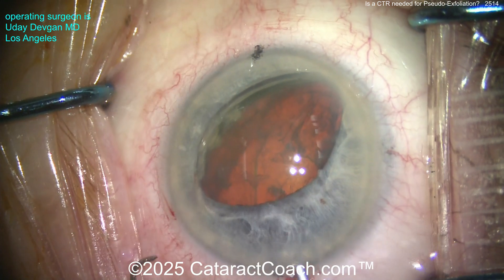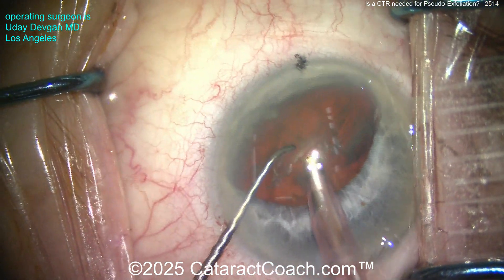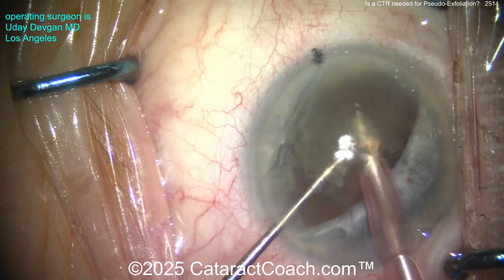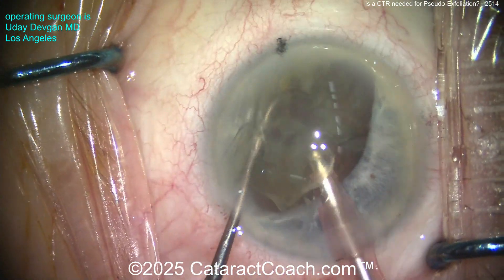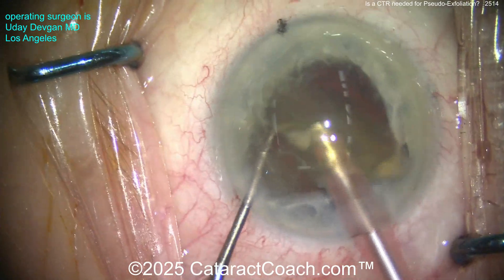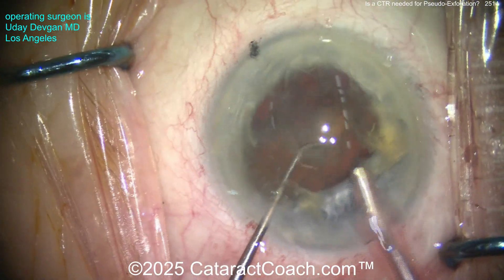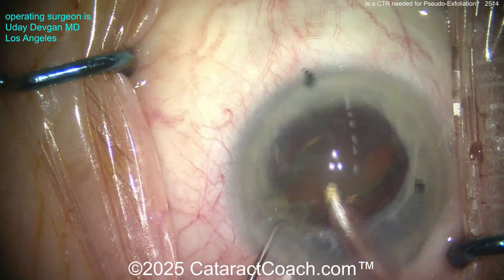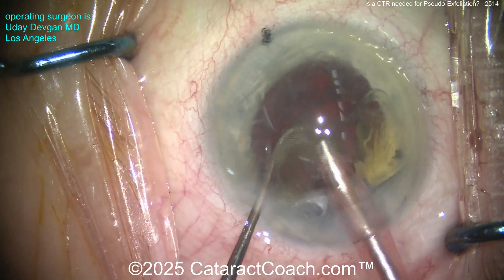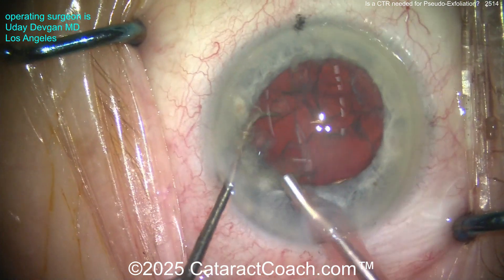A little extra aliquot of viscoelastic goes in. Phaco probe going in — this is the pink sleeve, the smaller sleeve — beveled down. Here comes the chopper in the side port. Buzz into the nucleus, chopper gets behind it, and two halves done. This first half — chop it again into quarters. We're operating basically at the pupil margin, staying centrally. This is not too dense a cataract, and we use phaco power modulations and high vacuum to aspirate the first hemi-nucleus very efficiently. Second hemi-nucleus: bring it up, chopper goes around, chop into quarters — each quarter easily aspirated.